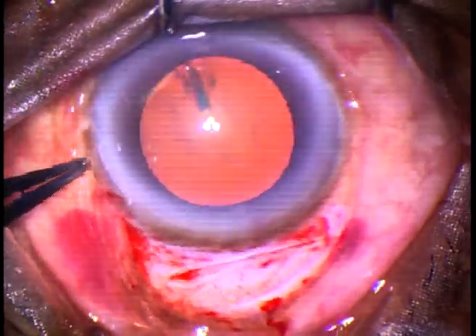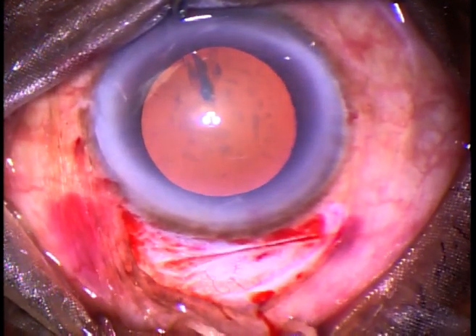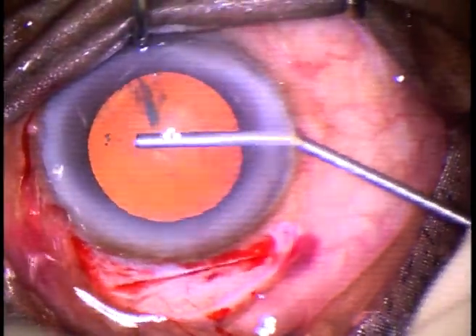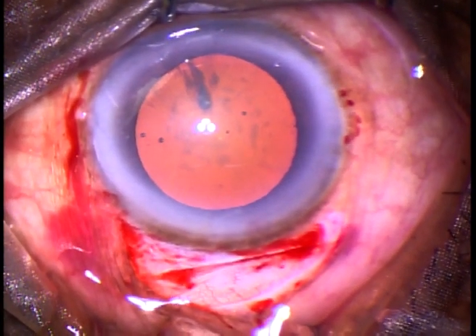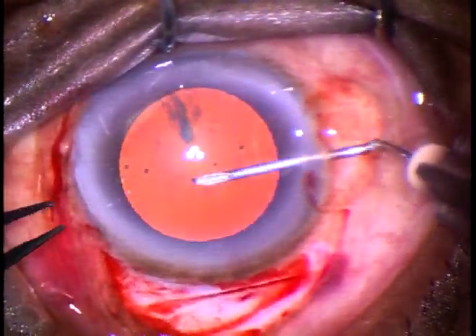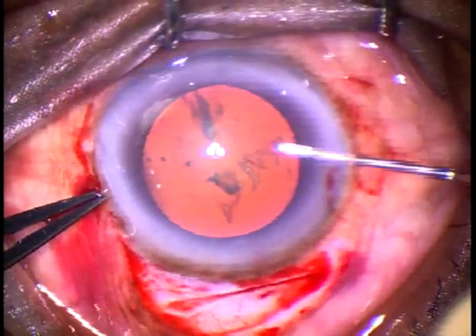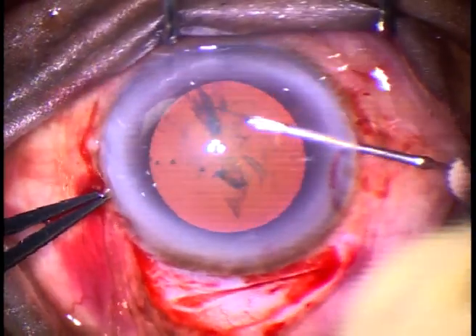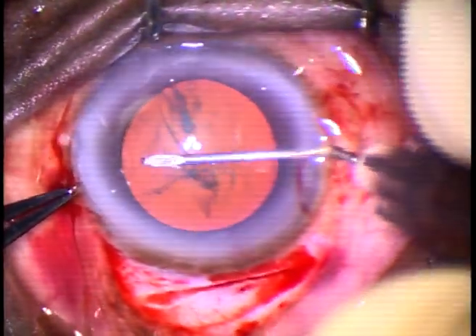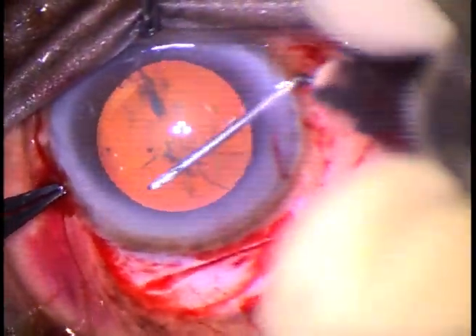And now, we have to do Capsulorhexis. This is a side port at 9 o'clock. Visco is injected into the anterior chamber. We are having good red reflex — this is an Omniglow attached to a Leica 690. Without staining the capsule, we can do this Rhexis. If we don't have red reflex, we can stain the anterior capsule with Trypan Blue dye and very easily do a Capsulorhexis.